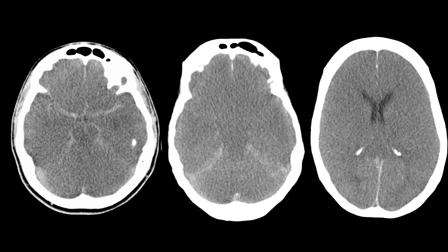Here is a different patient in which you can see the pseudo-subarachnoid sign mimicking the middle cerebral artery and around the basal cisterns, around the tentorium. You get this increased attenuation in the falx and around the superior sagittal sinus.